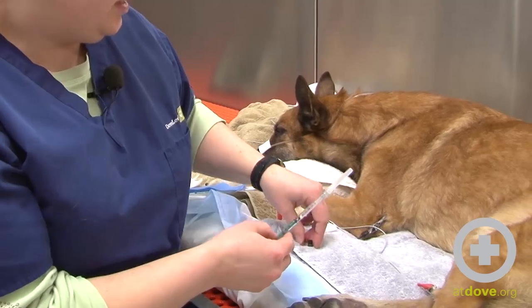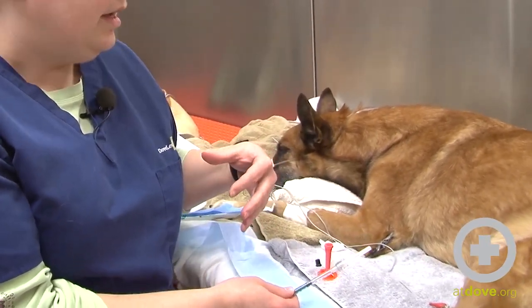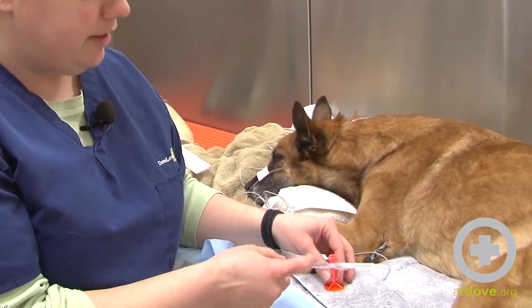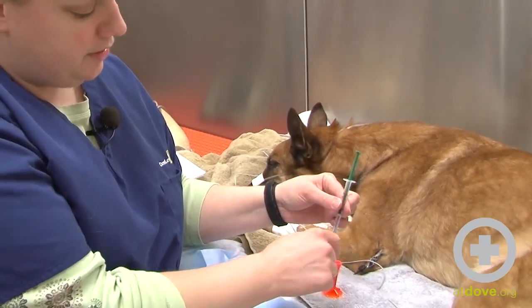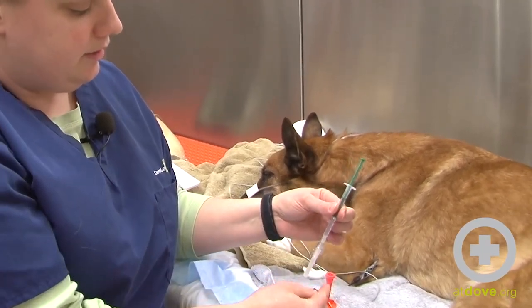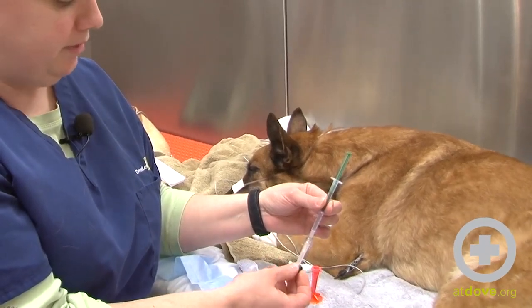When you do an arterial blood gas, it's important that once you get your sample, you don't want to mix it with any room air. With this particular syringe, it comes with a setup. Once I get my sample, I'm going to remove the needle from the artery and immediately stick it into here — all the air should be out of the syringe. This is a safety feature where the needle will get stuck in there. Then I'll remove the needle and put this little stopper on the end of the syringe so it doesn't mix with any room air.